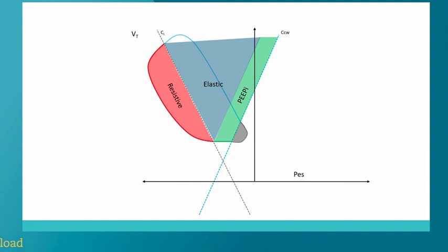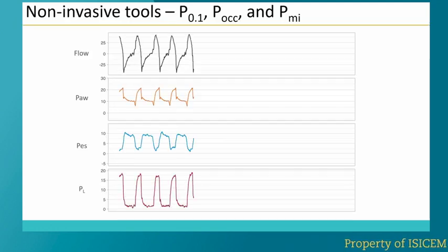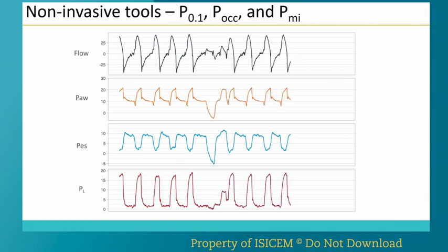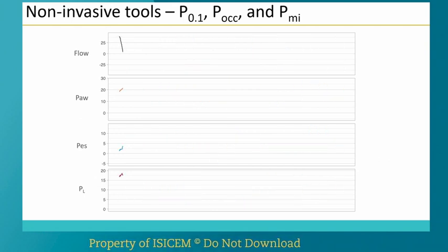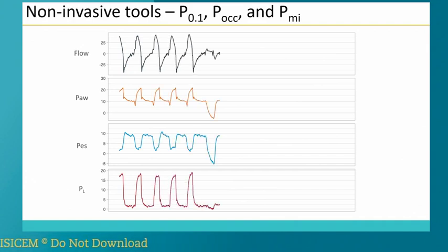You probably need some extra software to do it, but it's also something that you can do when you place an esophageal balloon to measure. So this is not the end. We have non-invasive tools, fortunately, because not every center has access to esophageal balloons, and although it's not super invasive because it's not different than an NG tube, probably it's not something that we do every day, and you do need to have some sort of expertise on how to use it. There are some caveats to how you inflate the balloon, position the balloon, etc.